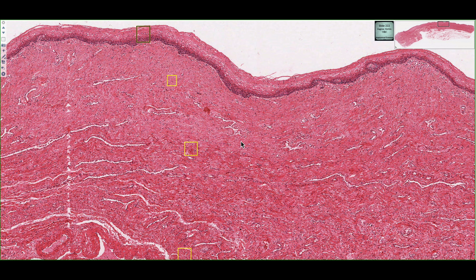In this tissue section, we're looking at a vagina, which is essentially a fibromuscular tube of the female reproductive tract, and it consists of three major layers.